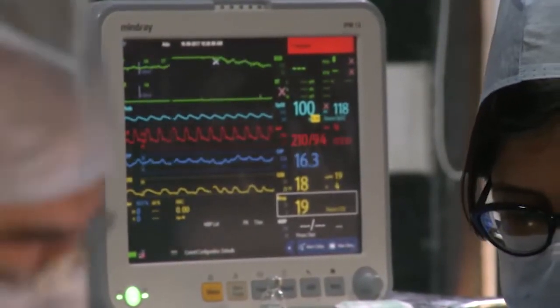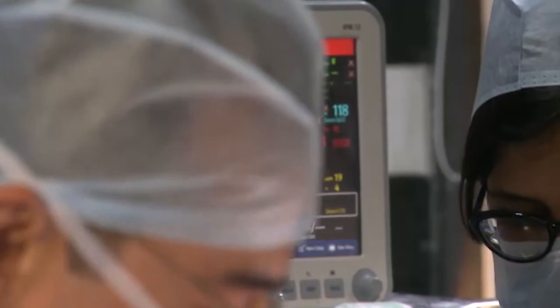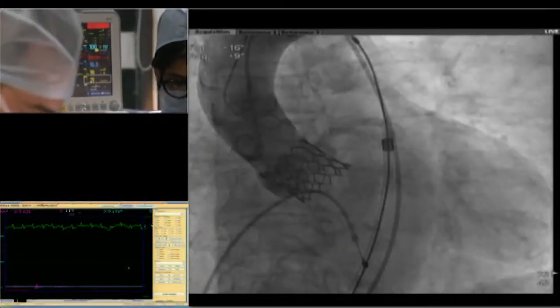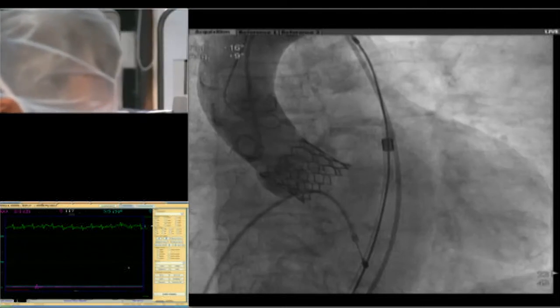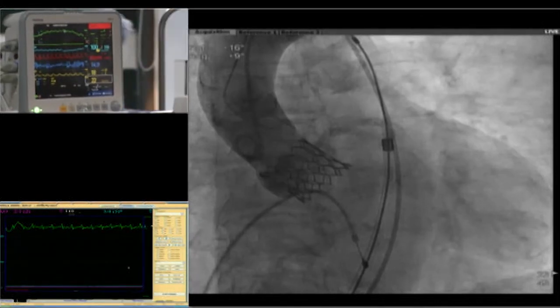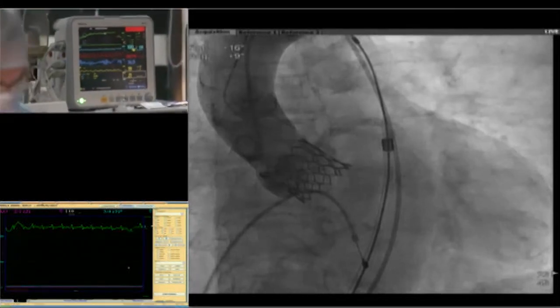Let us focus on the cine fluoro. Can we reduce the pressure? Can somebody play the previous picture? Cine minus. So let's get the blood pressure down. Let's give protamine. So we probably need to go from the other side and maybe put a covered stent. I think you're right.